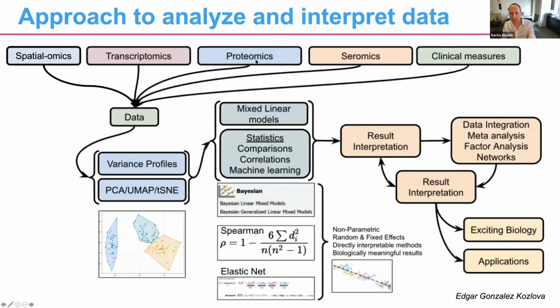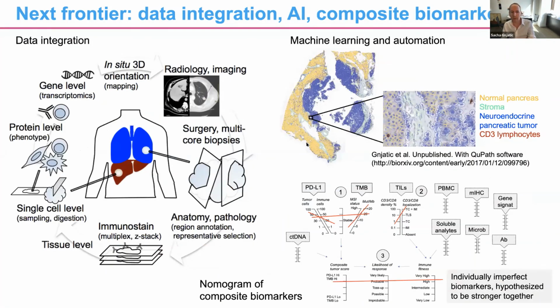Eventually, when we get all this data, we need to also figure out how to interpret it. We're thinking about analytical pipelines within each trial, but also across trials, and taking all the data generated from our various tier 1 assays, putting them together, and including things like clinical measurements and outcomes. So you can apply a bunch of linear mixed models and other statistics, as well as visualization tools such as PCA and UMAPs, to interpret our results and hopefully get data that is useful for identifying these biomarkers. So our goal is to now integrate these methodologies as much as we can into a set of both tissue level information, but also blood and host level information.